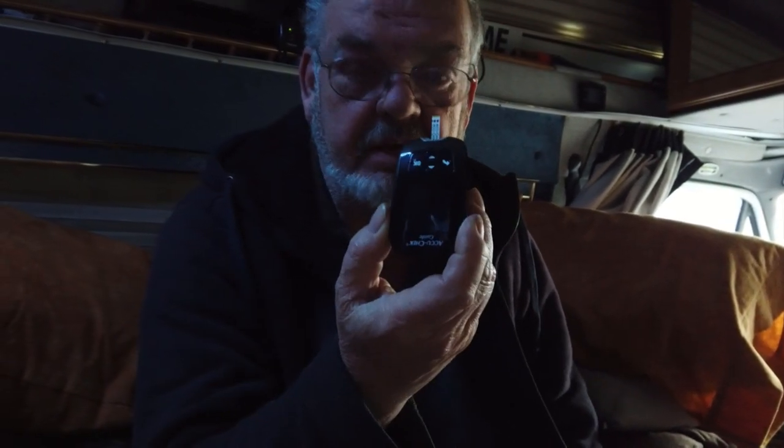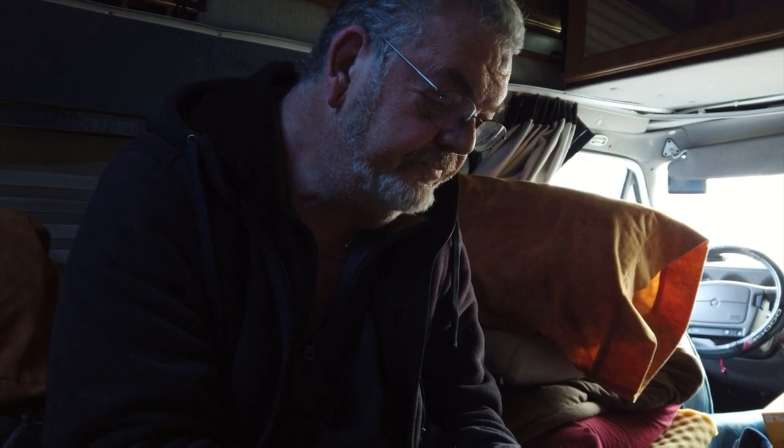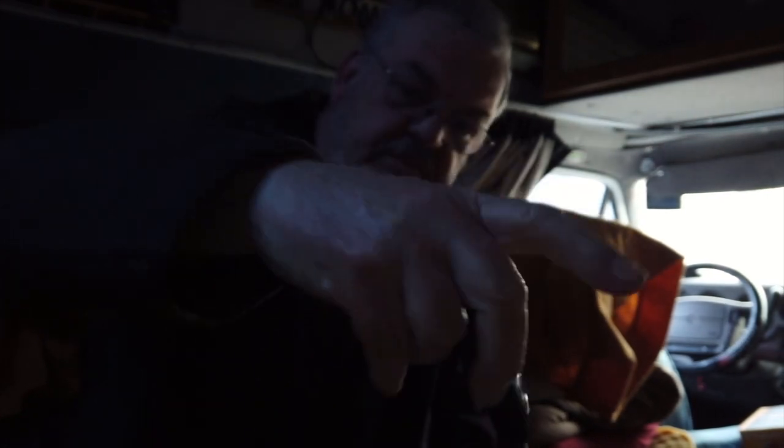Okay guys, it's Friday morning, nine o'clock. This is my last day for the meter test. Meter's here, got the lancet — let's take our reading before breakfast. 7.1. Now I think I said that for a normal person it's between 5 and 7, so 7.1 is just a touch above.